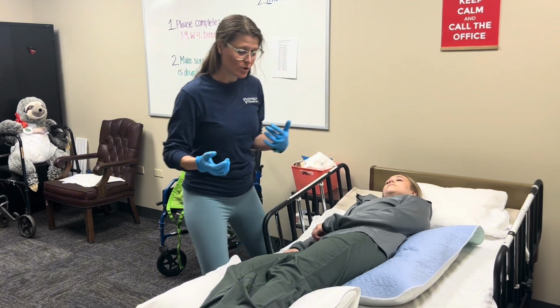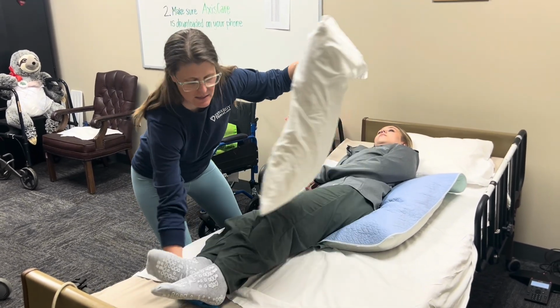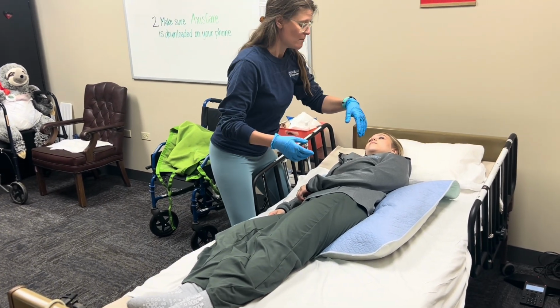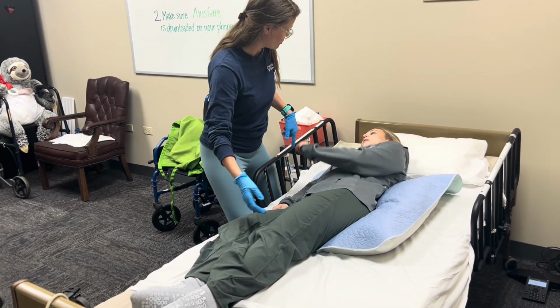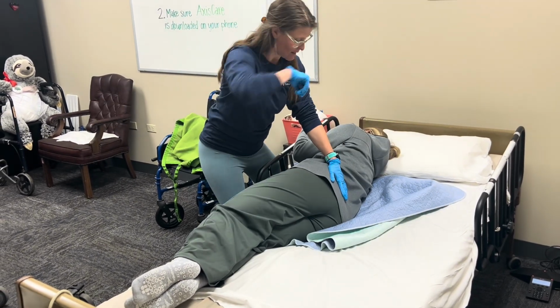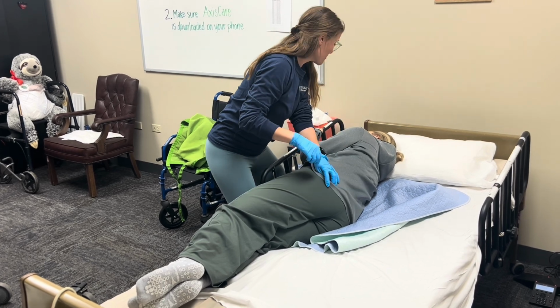Okay, Michaela, what we're going to do is start by getting this pillow out from underneath your legs. So I'm going to pick up your legs. Okay, perfect, and down. And I want to make sure that I have everything with me, right by my side. Michaela, are you able to do a little bit of a roll? Can you roll over and reach for the bed rail? Perfect. Okay, I'm going to take this pillow out. And while we're here, I'm just going to check your briefs to make sure you're clean. Okay, perfect. We're ready to go.